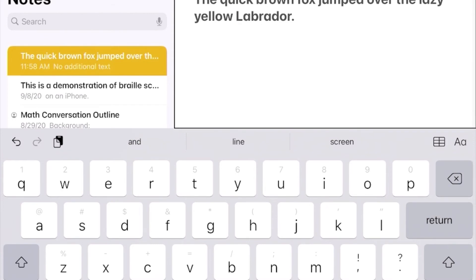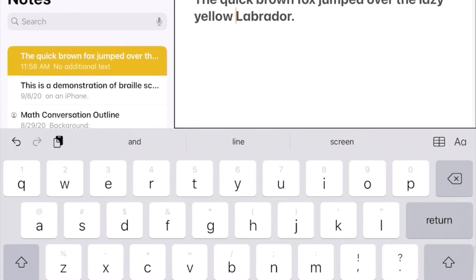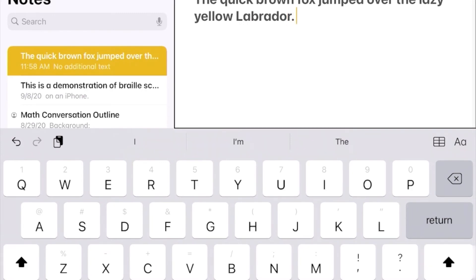To move your cursor to a specific point in the text, use your cursor routers — press the cursor router above the cell you need. You can also use the rotor to move through text: use space dots 2-3 or space dots 5-6 to turn the rotor. With the rotor on Characters, use space dot 6 to move along the word character by character. You can also use this method for text selection or copy and paste from your Braille display.